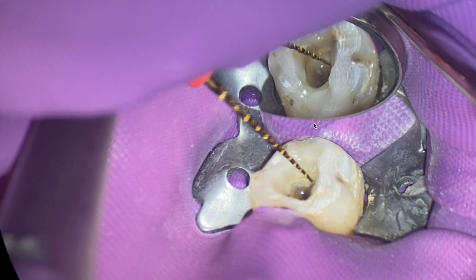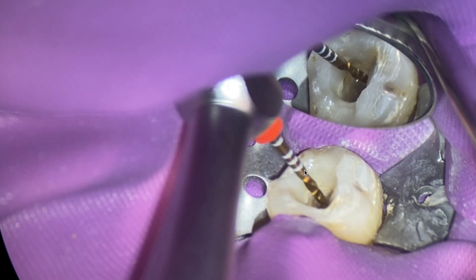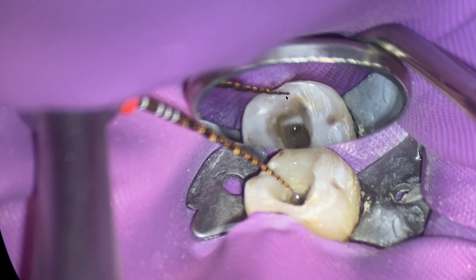The second thing that's really important is to know the pattern. Let's take a look in the mirror — kind of memorize what the pattern is of your file. For example, let's take a look at a fresh WaveOne Gold. You can see the helical pattern. I know after using this thousands of times that this is the pattern of the apical portion of the flutes.